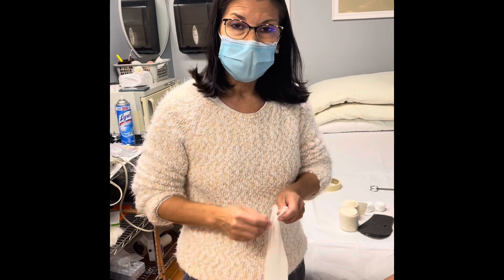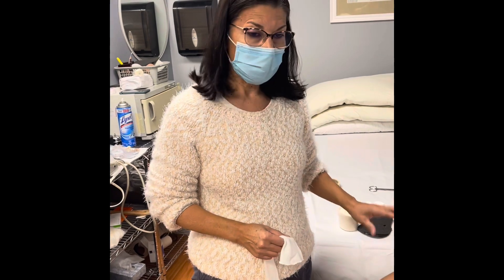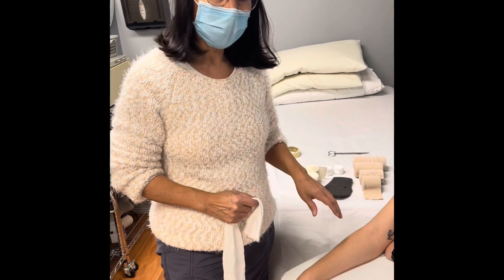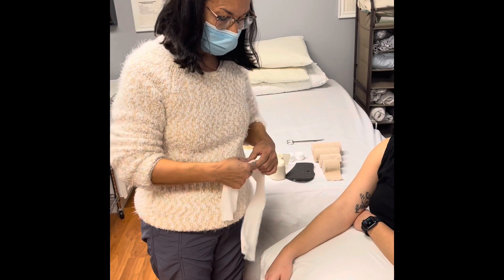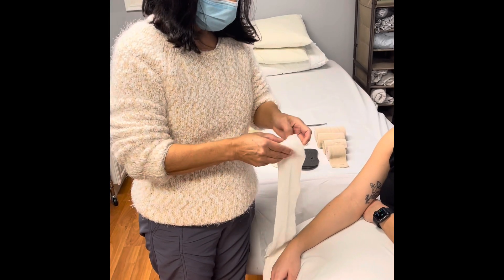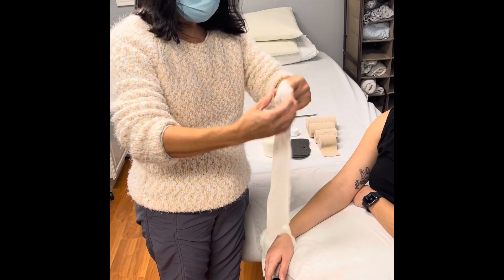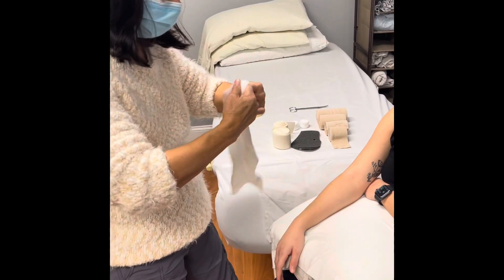We're going to demonstrate bandaging of the upper extremity. We have already done the manual lymphatic drainage and applied lotion on the skin before bandaging. We are using our stockinette, which is light in nature, and we cut out an opening for the thumb prior to putting it on.